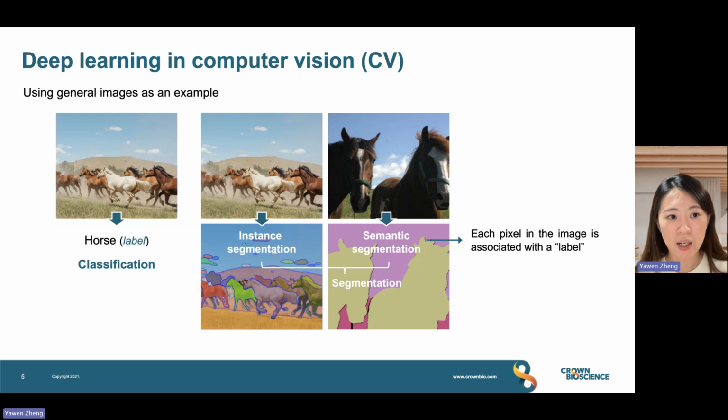And we believe that the segmentation and the classification task are pretty similar to our project, because in our project we want to use the deep model to assign the pixels in the preclinical histopathology image with a label information, which can make the parts in this image are marked by different colors, right?